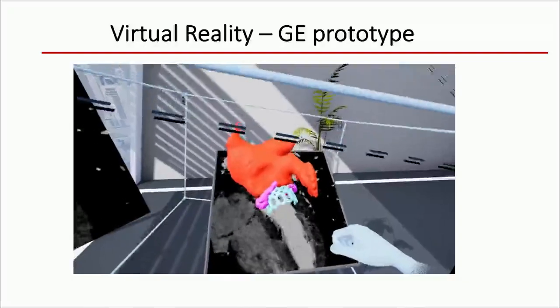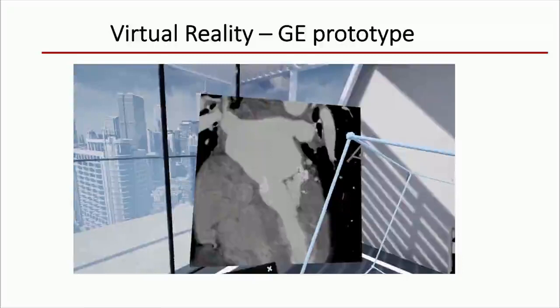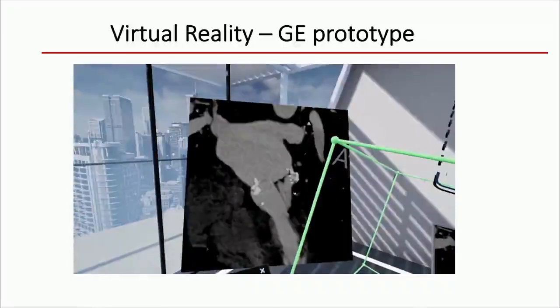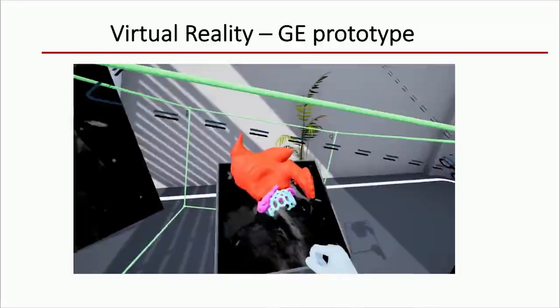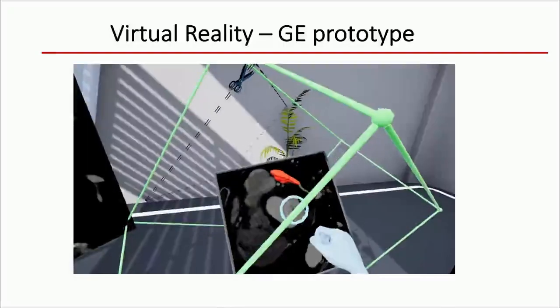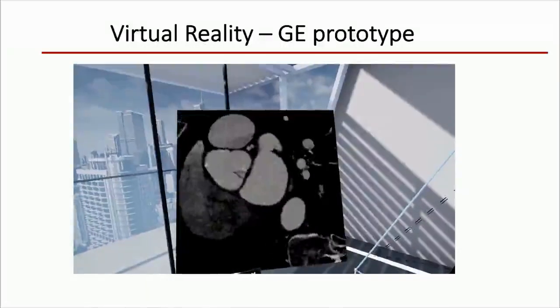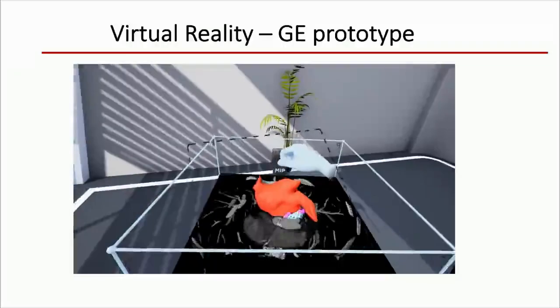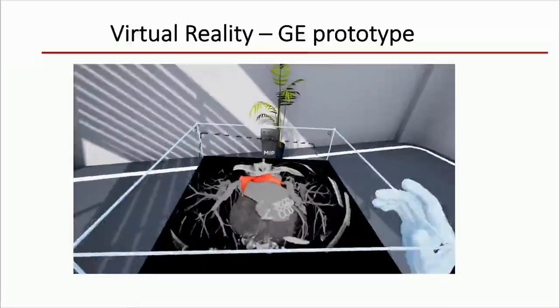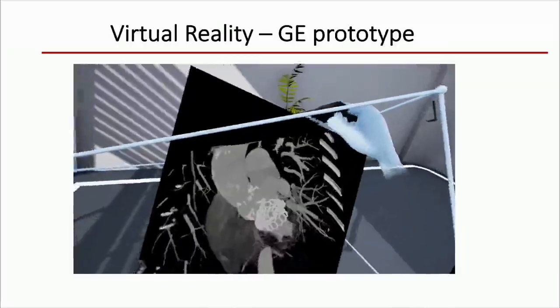It's very clear that imaging cardiologists have a wealth of experience in analysing CT datasets and echocardiographic datasets, but the real goal in all of this is making sure that that information is communicated adequately and effectively to our colleagues who are going to be performing the procedures, because invariably and inevitably that is anticipated to improve procedural outcomes. And here we can see Professor Redwood using our virtual reality platform to try and understand the anatomy better before he actually proceeds to the case.